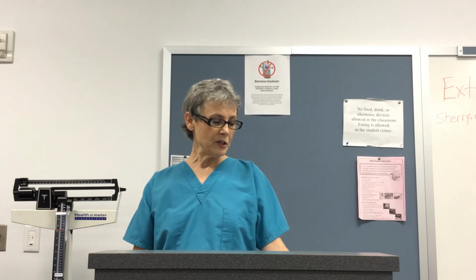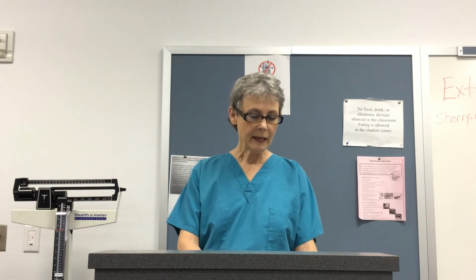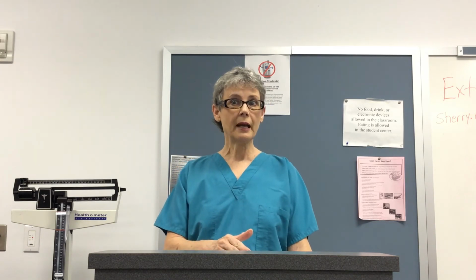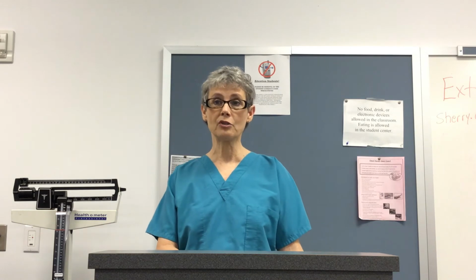Okay, now we're moving to maintenance of IV sites. And of course, as always, you follow your facility's guidelines. Now, if you come to check at that 2-hour mark, and you see that maybe there's some blood or drainage under the dressing, or the dressing is not adhered anymore, or it just looks like it needs some care, by all means, go ahead and take that dressing off and redress it.